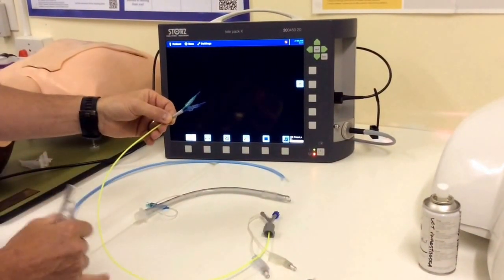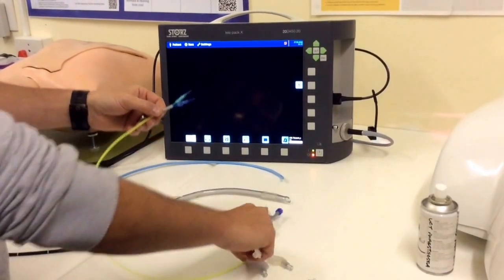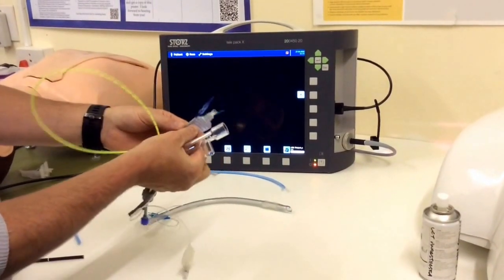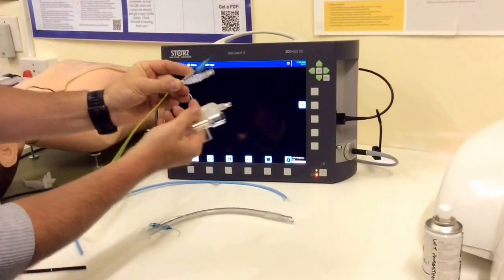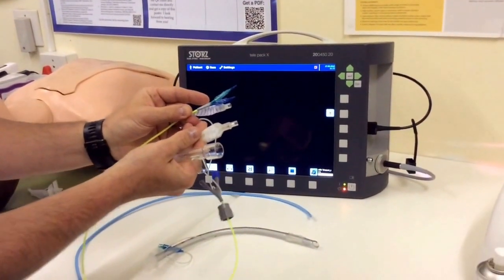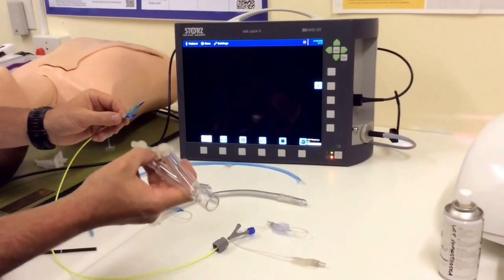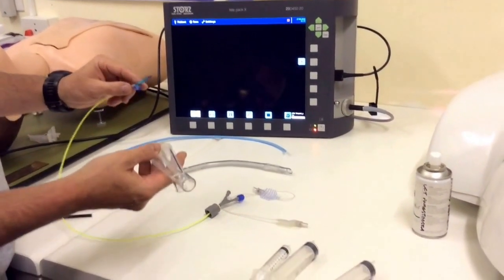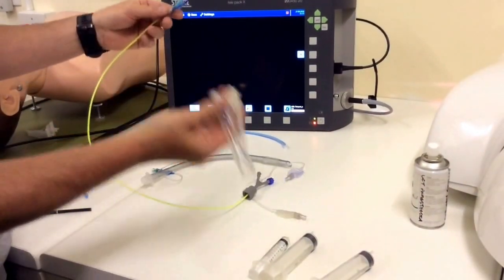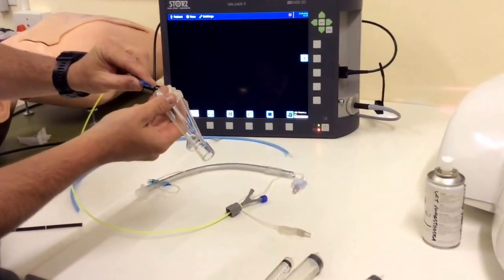The EZ Blocker has got two cuffs, and the idea is to place this at the carina so we can isolate either the right or left lung by inflating the relevant cuff. The cuffs are more or less yellow and blue, and the pilot balloons are also yellow and blue so you can recognize which cuff is which. Before your case, prepare these carefully so you're ready to go and it doesn't cause any delay. Lubricate your EZ Blocker and your cuffs.